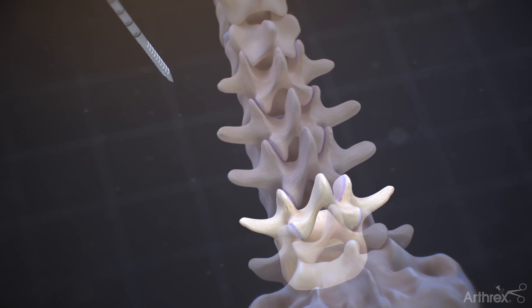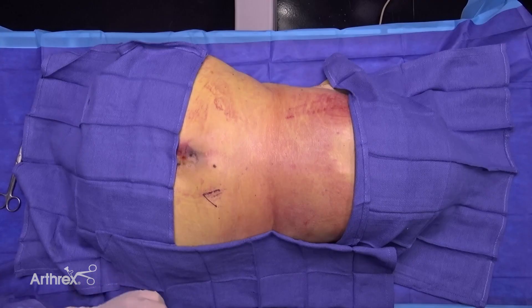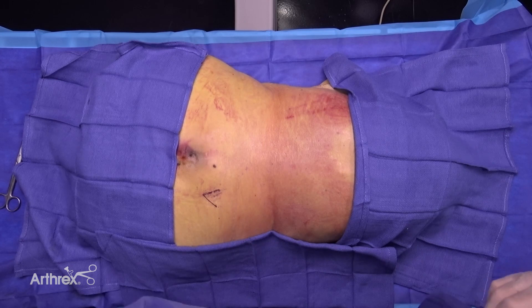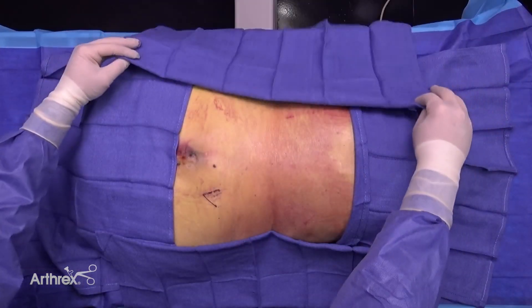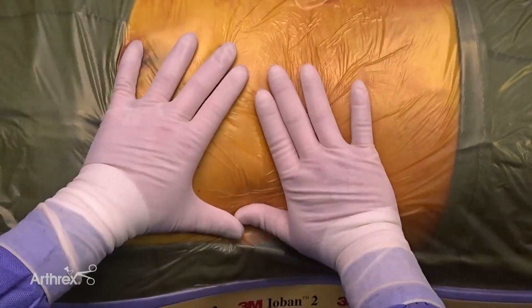This approach is ideal for posterior, transforaminal, and lateral approaches where the patient is maintained in a single position throughout the entirety of a procedure. The patient is prepped using a standard draping technique for your approach. An example of a standard draping technique for a posterior approach is shown. Note, the use of a C-arm is recommended to assist with proper targeting for this approach.